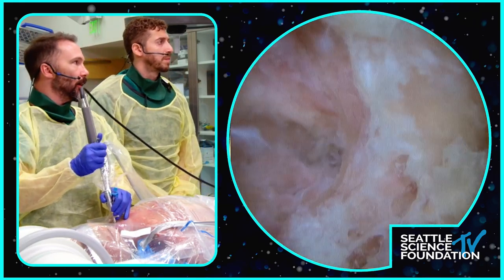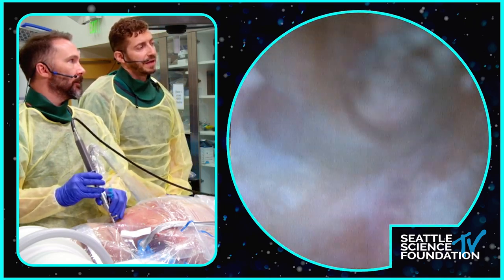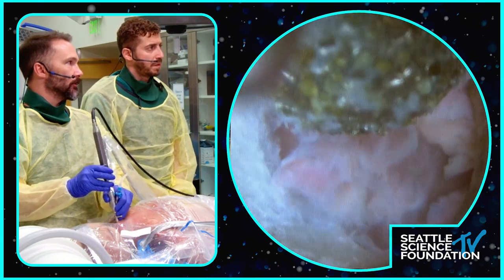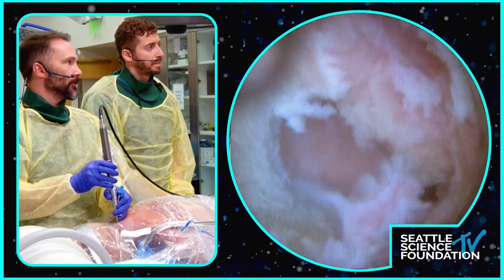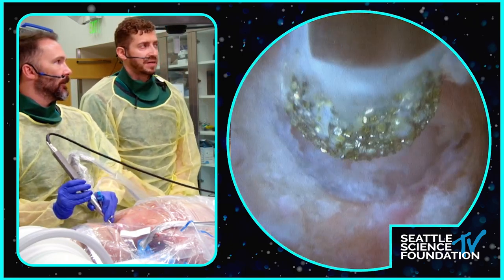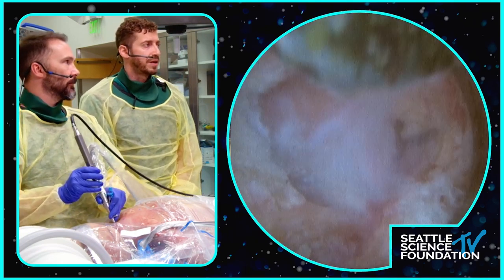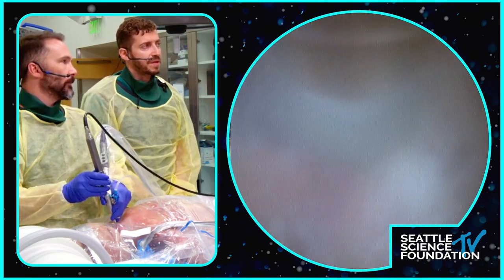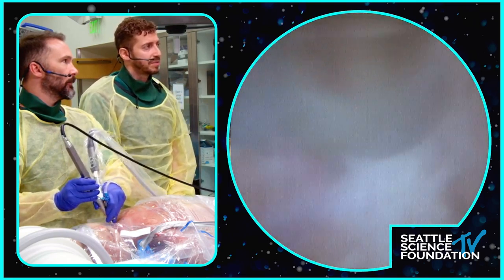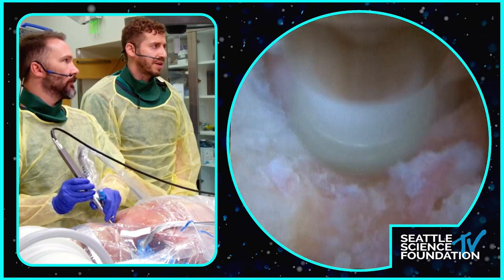Making progress going lateral. Looking for the lateral edge of the thecal sac, which I think is sort of coming into view. I've got to do a little cleaning up, but we'll be seeing that soon. If you go more lateral, you're doing a foraminotomy; if you go more medial, you're doing a laminectomy. It just depends on the goals of the procedure — is it ligamentous hypertrophy and myelopathy, or radiculopathy? This has definitely minimized the number of fusions being done, which is great. People can do this bilaterally, and multilevel — those are all possibilities once you learn and get efficient at it. It's a very fast procedure, within 45 minutes, and you can really check that you're completely decompressed in the correct areas.